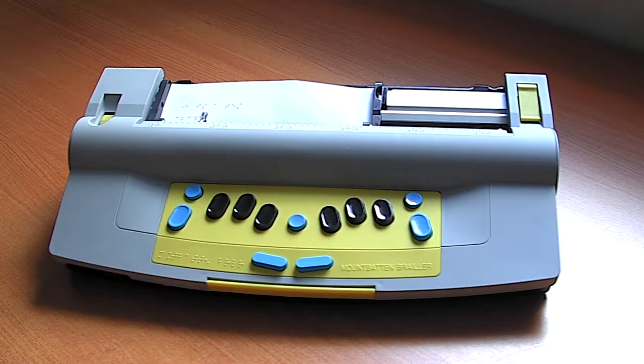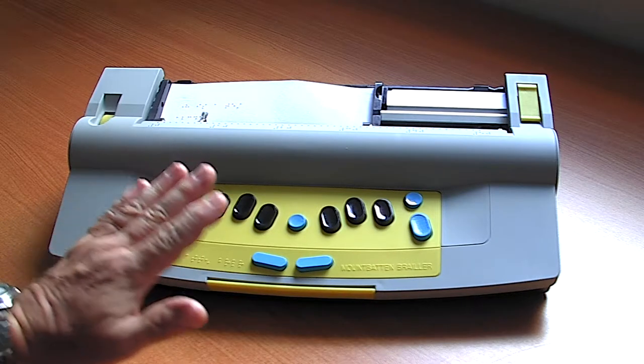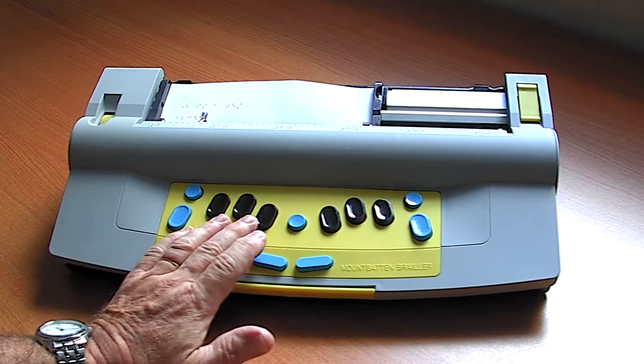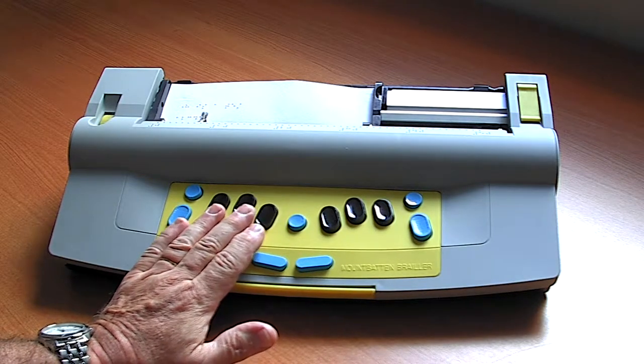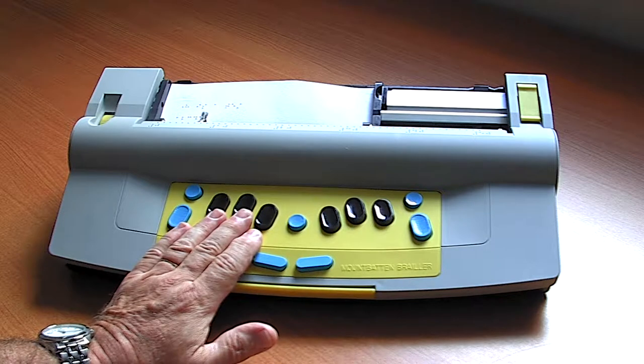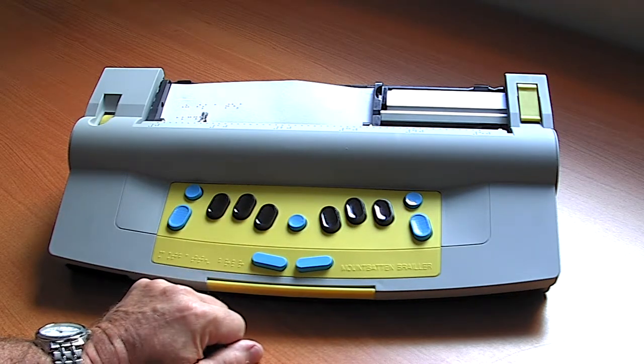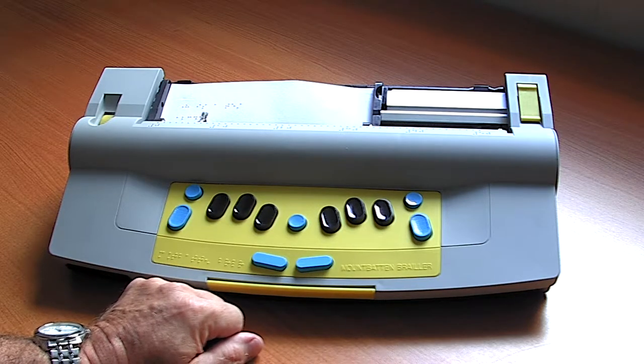The Mountbatten Brailler has been an important tool for Braille learning, especially for early Braille learners, since 1990 and it continues to be developed. The basic concept of the Mountbatten compared to a mechanical Braille writer is that the keys have a soft touch, which means that an early Braille learner does not require strong finger pressure to actually form the Braille, and this encourages young Braille learners to start early in their Braille journey.